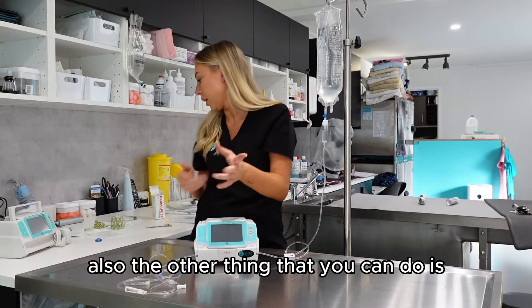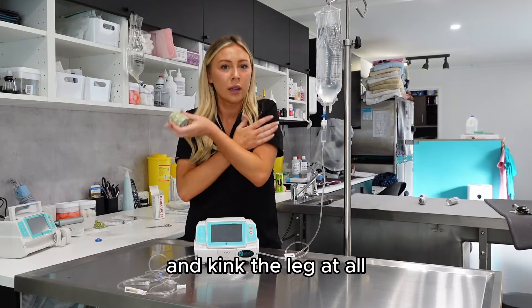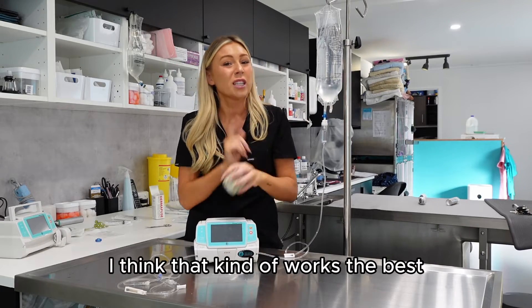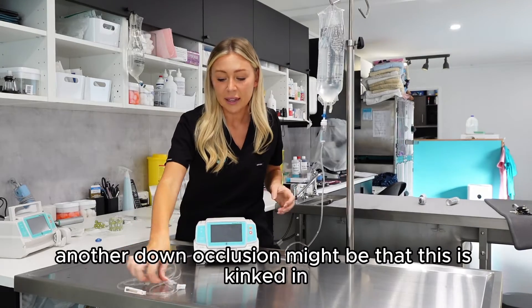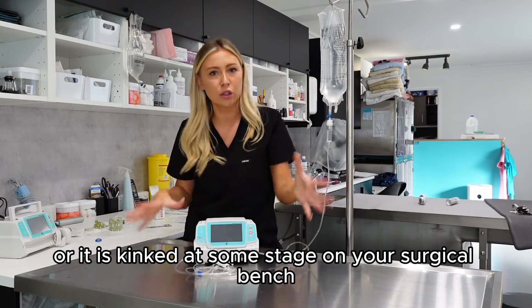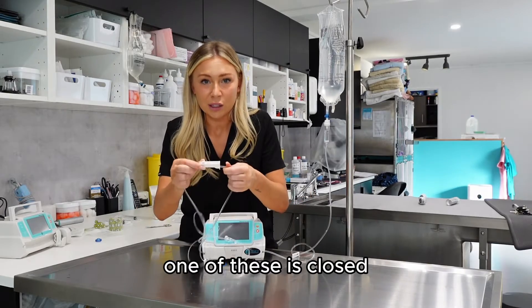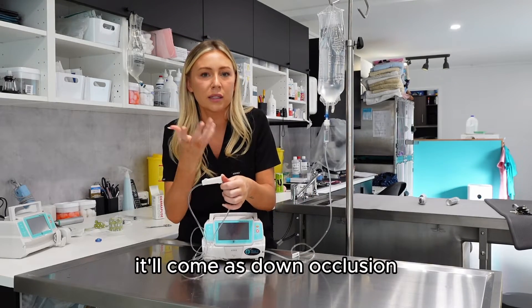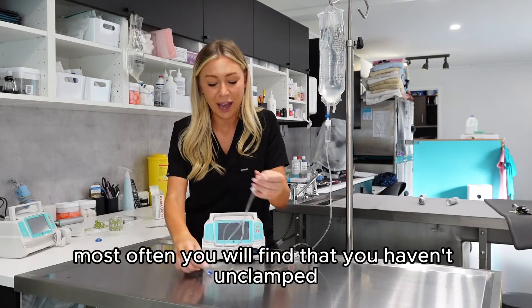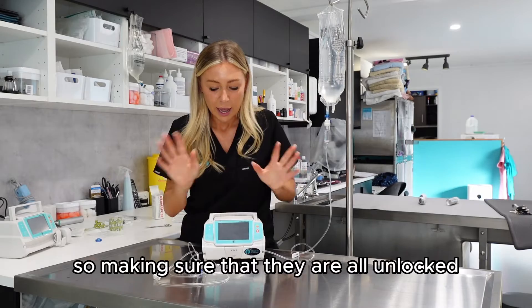Keep catheter placement in mind when placing your lines. You can also wrap the leg so the animal can't physically tuck and kink it — keeping it firm and straight works best, especially with cats. Another cause of down occlusion is the line being kinked in the cage door or on the surgical bench, so visually inspect the whole line. It could also be that a clamp is closed — make sure all clamps are unlocked and open before connecting to your patient.